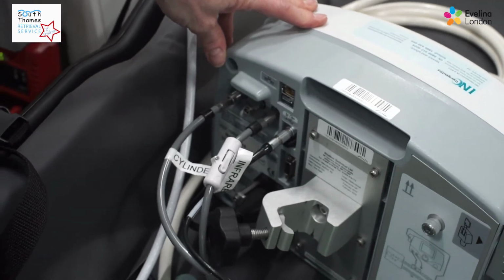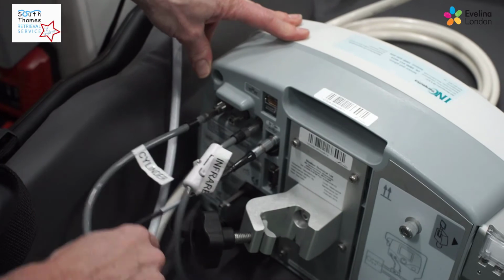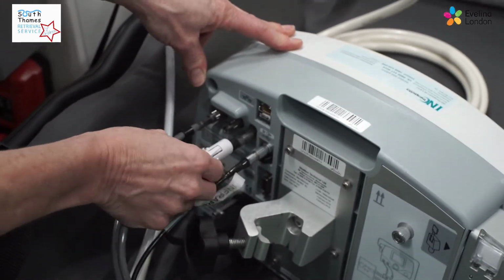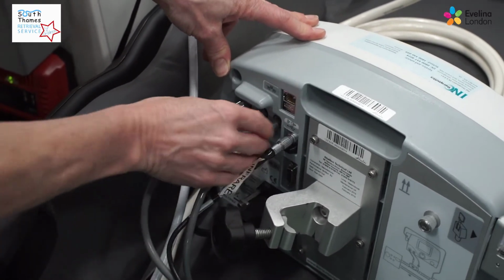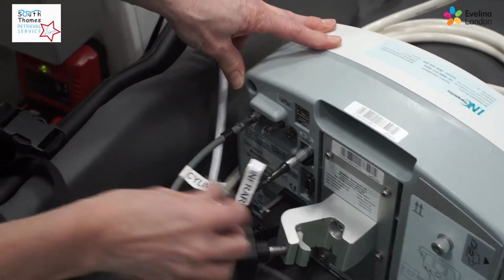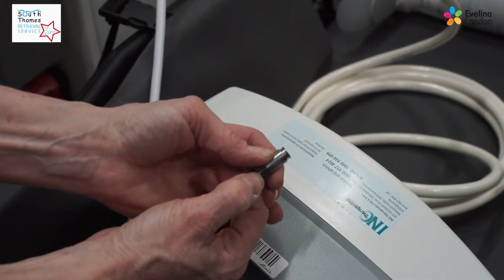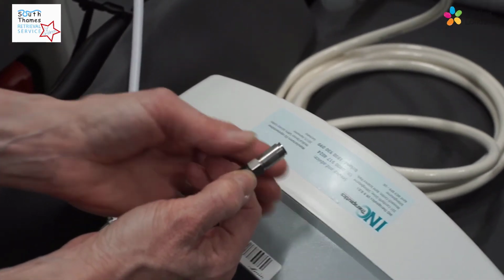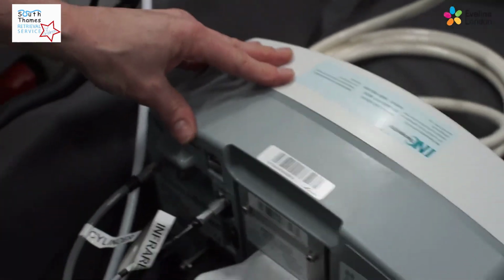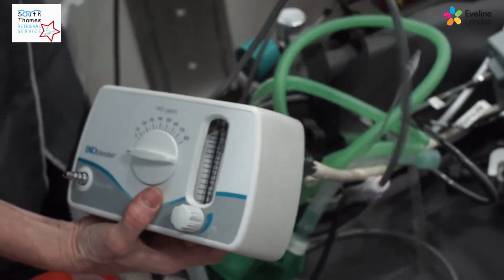So you then need to transfer your nitric blender onto the wall, onto the bracket. You do that by disconnecting the blender lead. It's the one that's covered by the white cap. And you pull the collar towards you and it comes out. And this is the collar that moves. Then you need to bring the nitric blender.